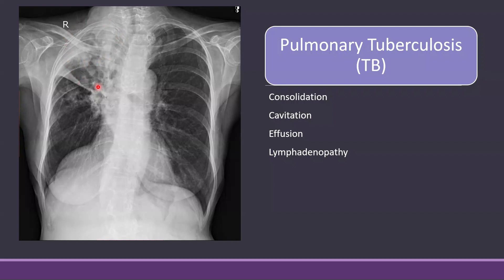Usually for white opacification, the differential is consolidation, collapse, or effusion. This is obviously not a common site for effusion — effusion is usually seen at the bases. Within this opacification you can see there are areas which we call air bronchograms. These are the areas you can see here inside this opacification. Air bronchograms are typical for consolidation.